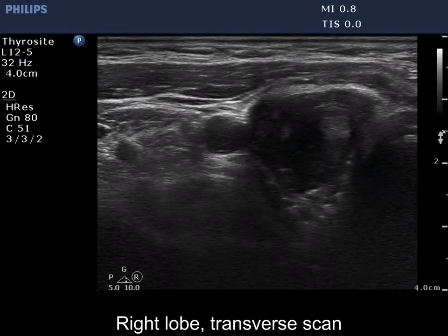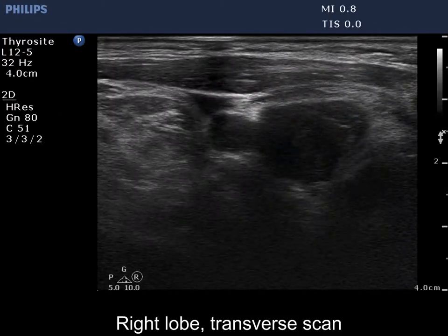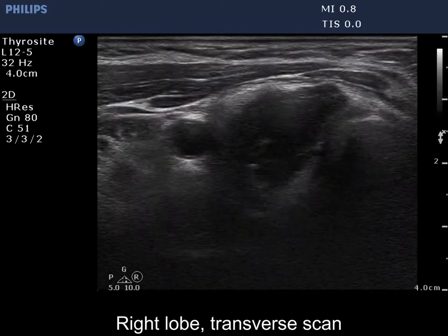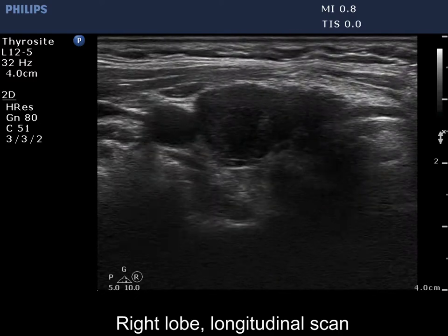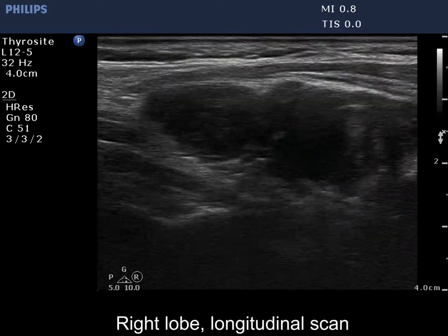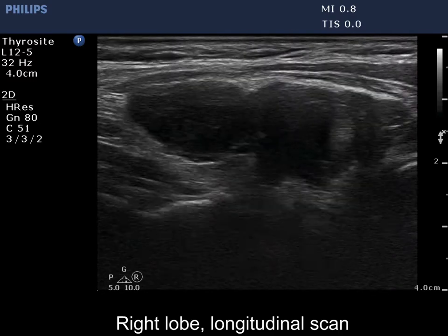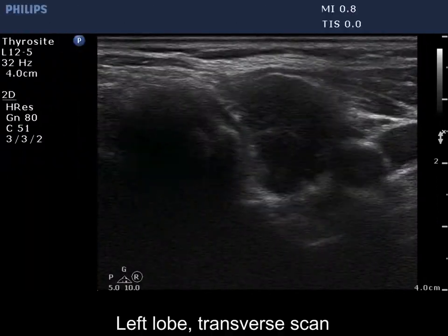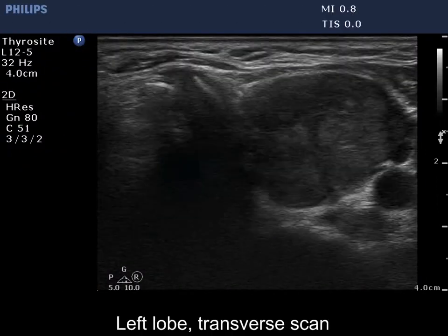The shape of the thyroid is irregular. The lobe is basically composed of a central large hypochogenic part surrounded with an echonormal thin rim. The left lobe has a similar appearance.